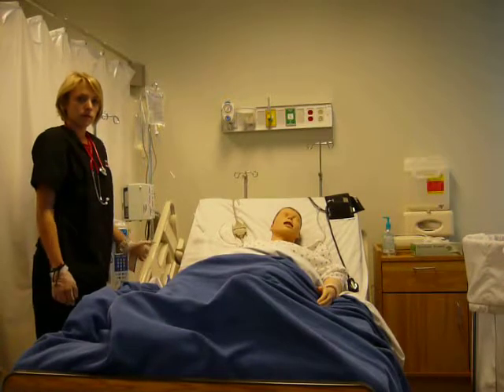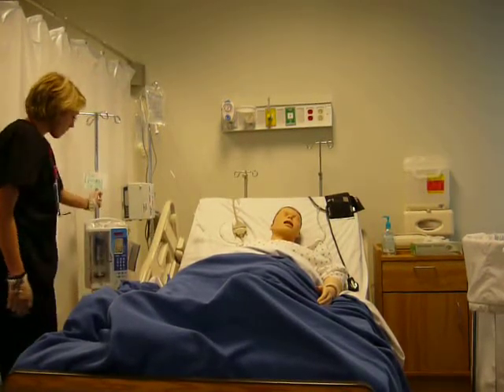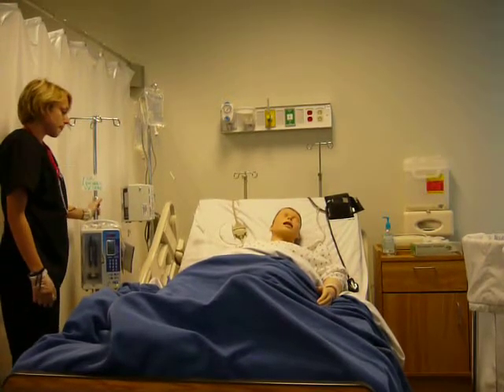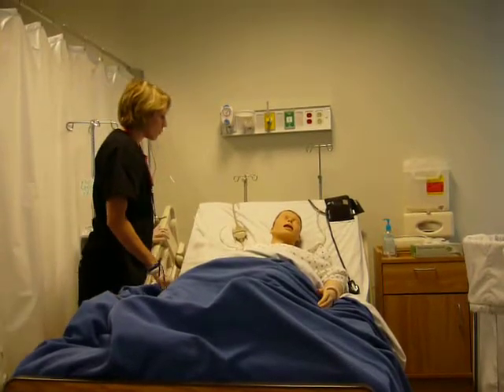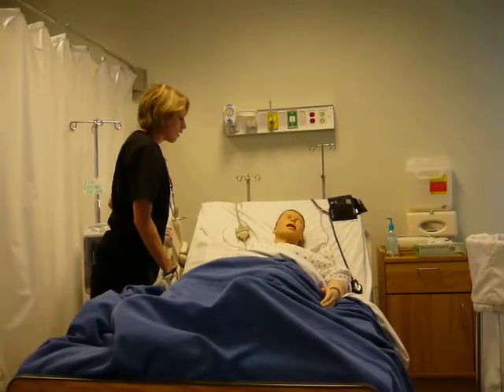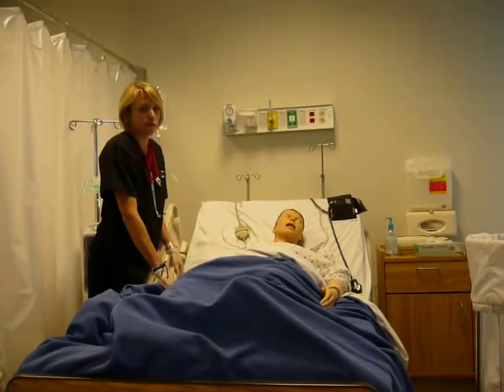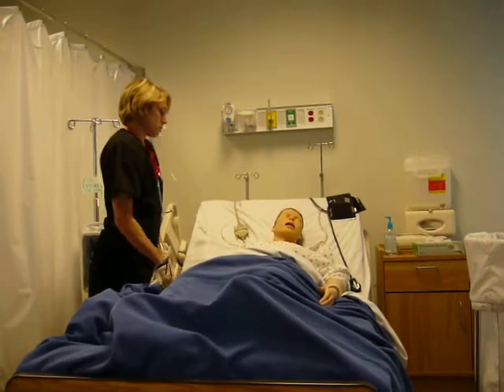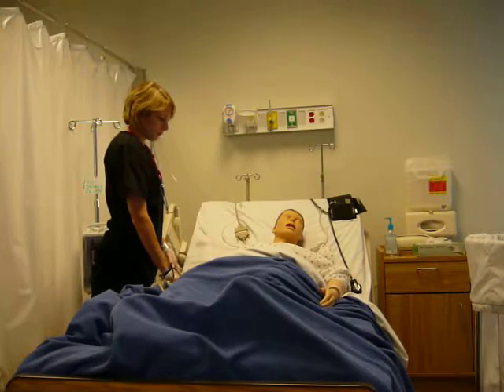You're going to want to continuously monitor the infusion device's rate throughout the day as you're taking care of the patient, to make sure that the device is properly working and they're getting the proper amount of medication. Mrs. P, are you having any more pain since we've given you the epidural? She's having a 6. Before, it was a 10, so that's very good. So you would definitely want to make sure, as Olivia has done, to reassess the patient's pain level.